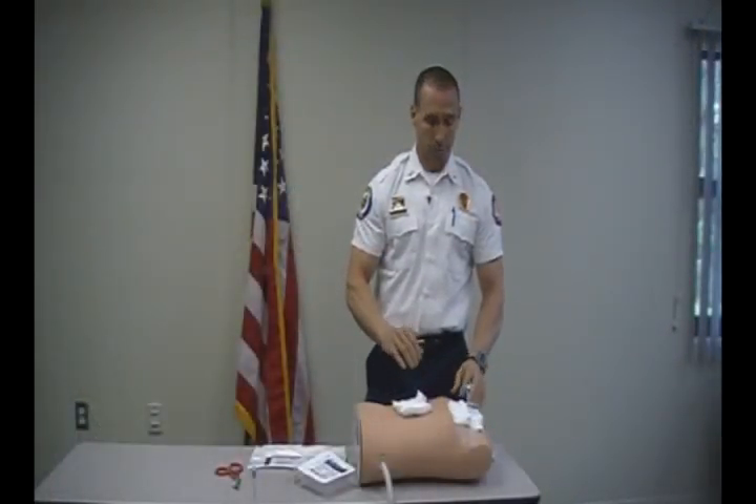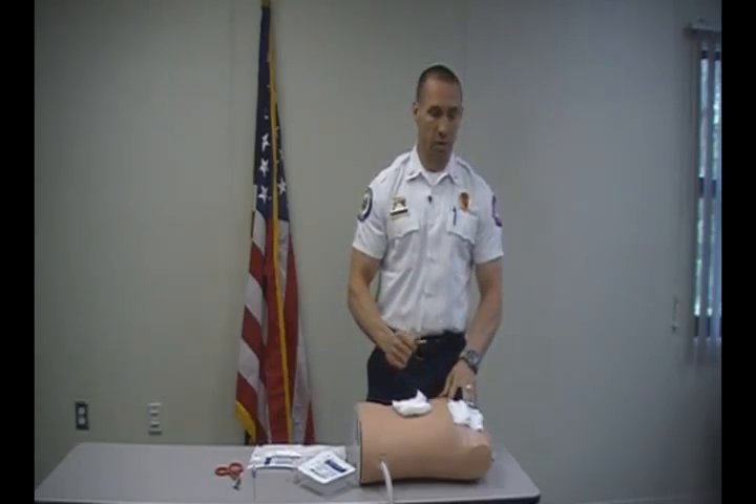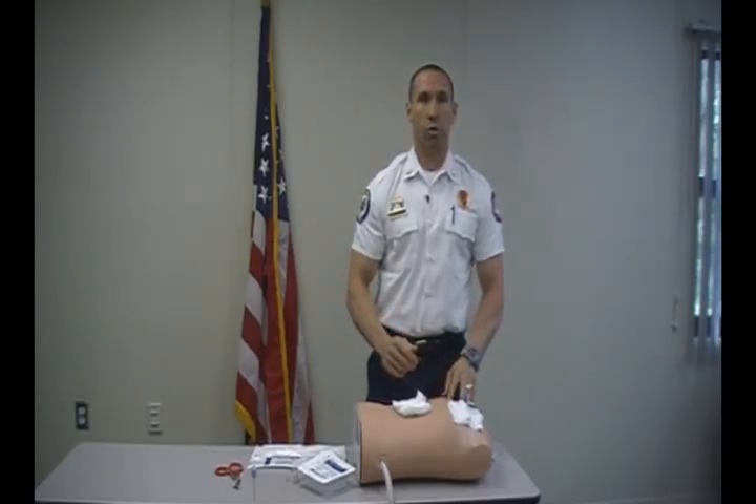Use your stethoscope to check your lung sounds. Again, they should be breathing easier. You should have clinical signs of improvement. The procedure is complete.